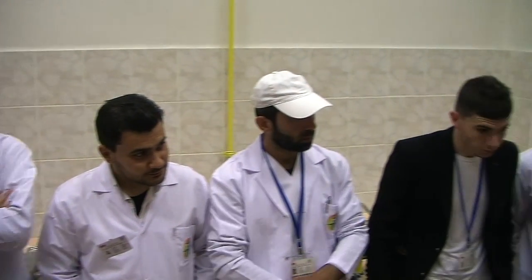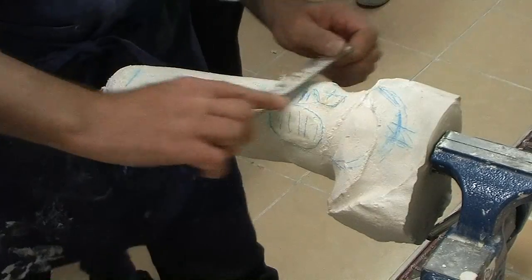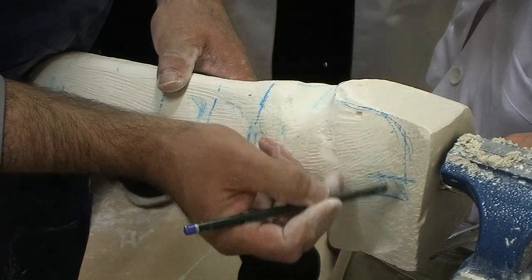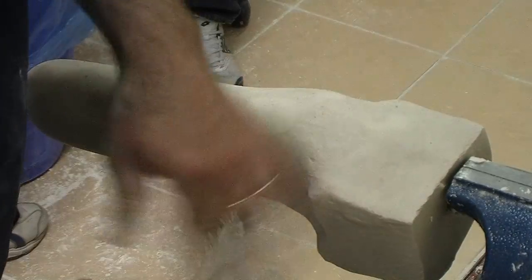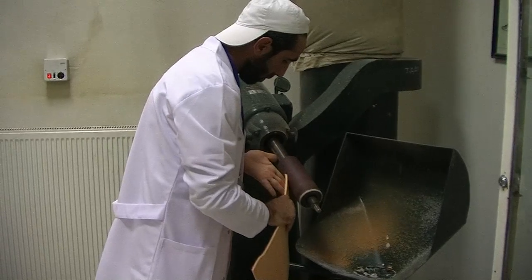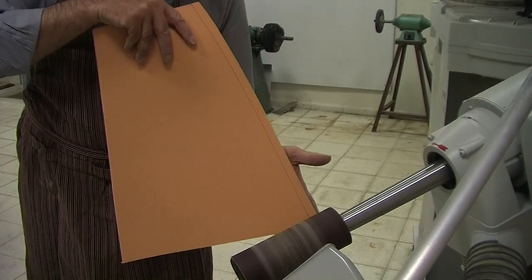I've already pulled the negative off from the positive, so this is what we got. Now I can take care of this. The next step after the rectification, when we are satisfied with our plaster model, is to prepare and produce a soft inner socket before we do the rigid thermoforming socket.